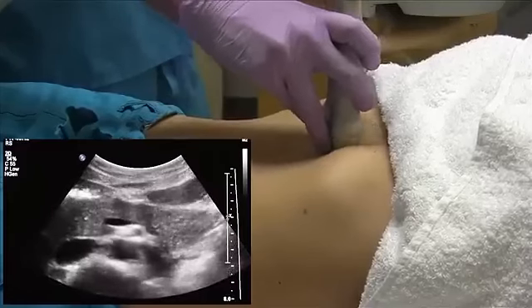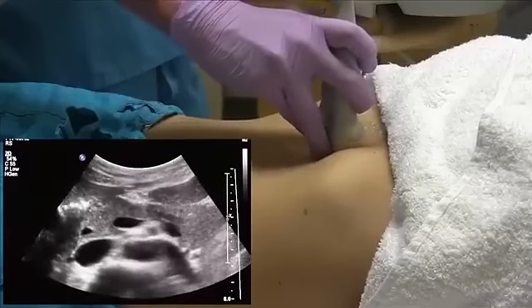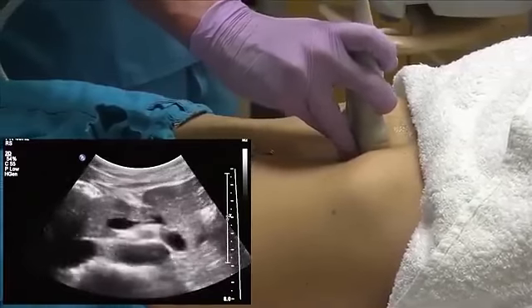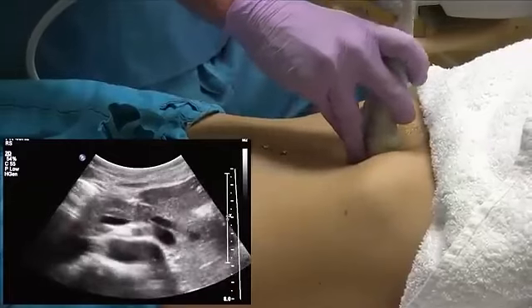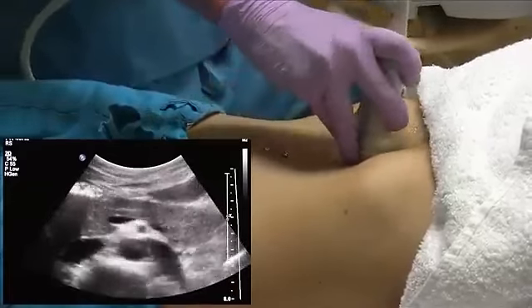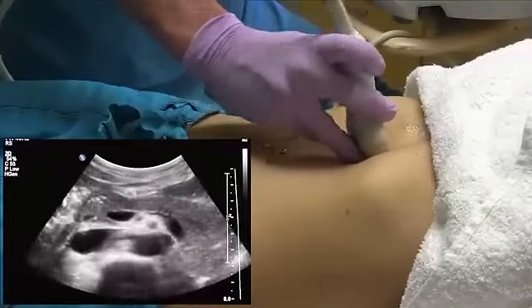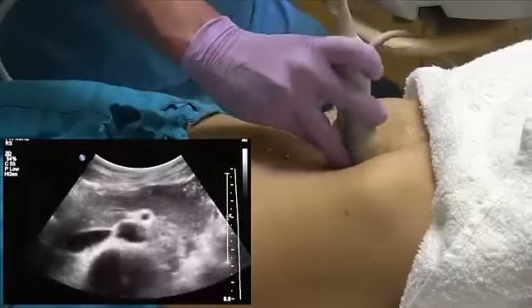If you look on this image here, the splenic vein is a good landmark to let you know that you are very close to, if not exactly on, your pancreas. And like every organ, you need to sweep through. If you just see the splenic vein and take pictures here, you can miss other pathology in the pancreas.